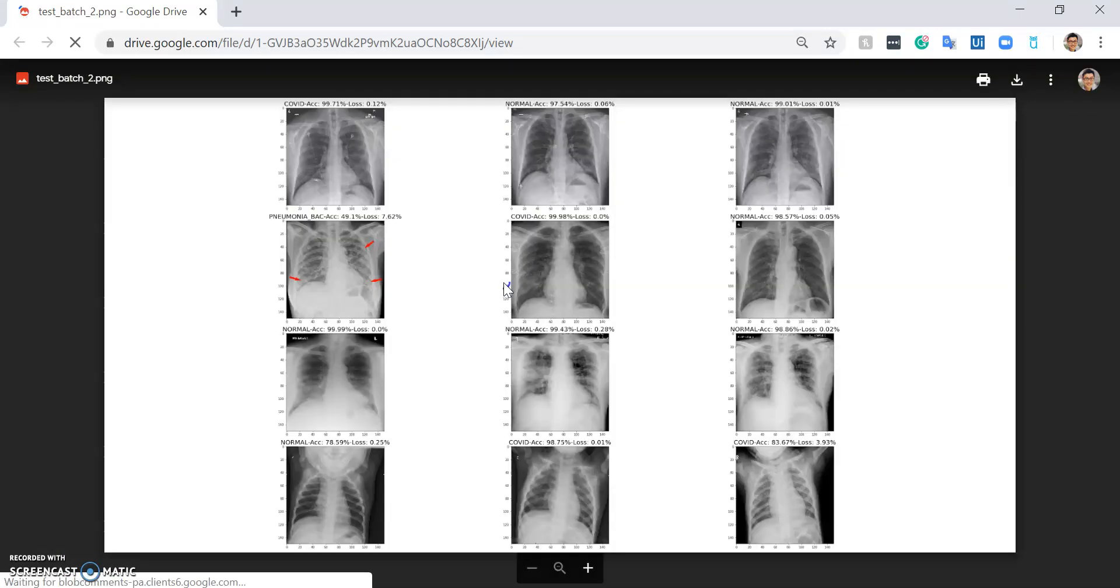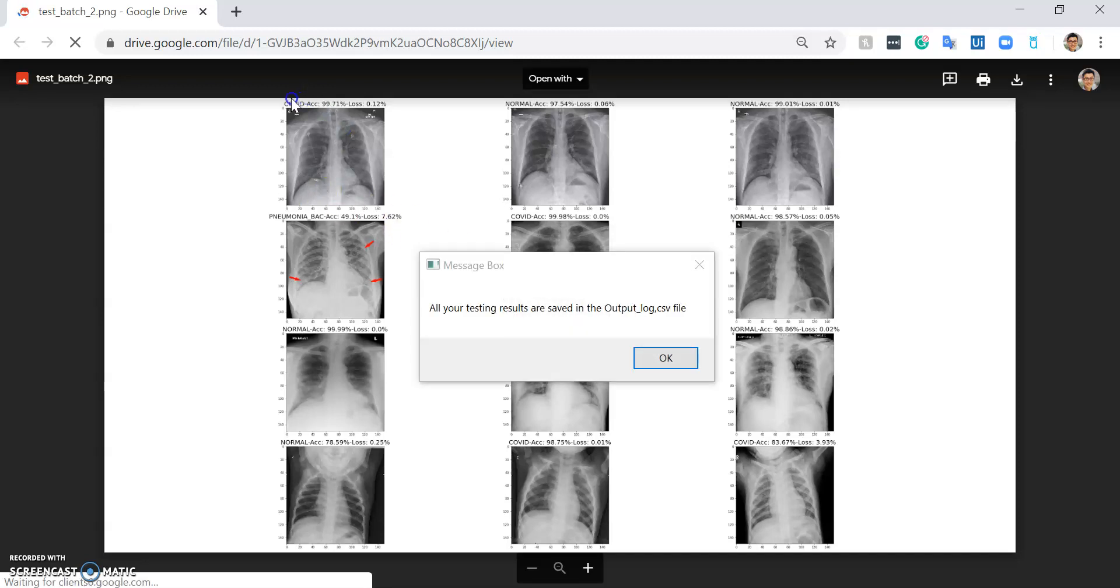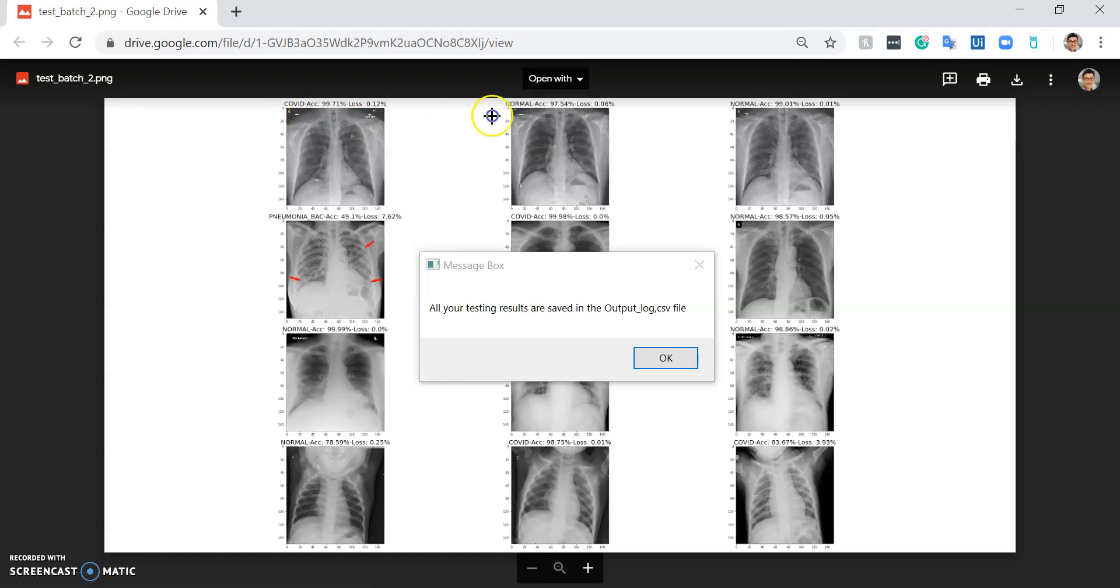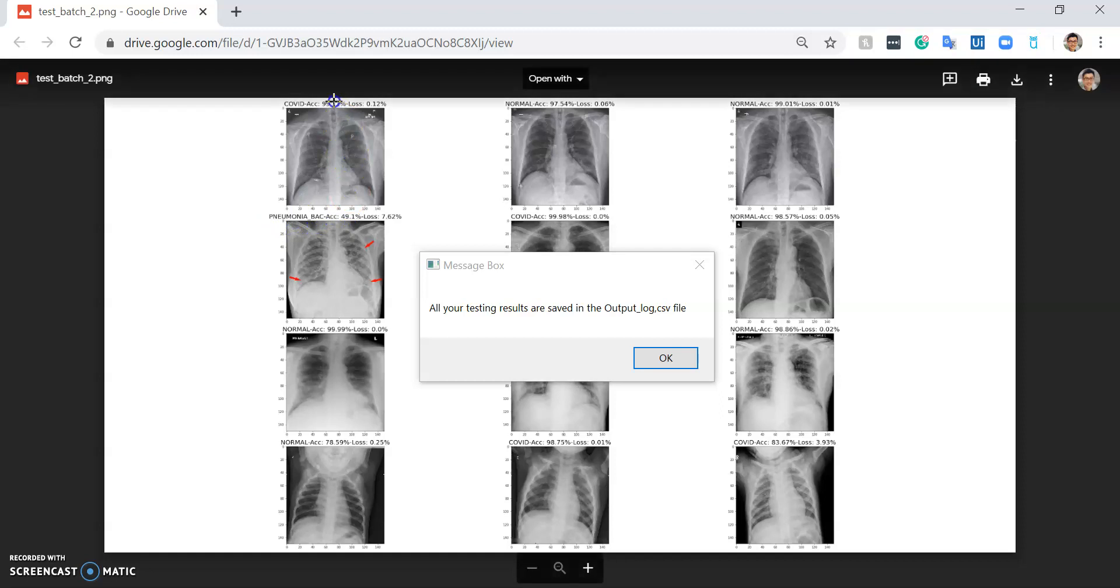After that, it will open the result for me. As you can see, the chest x-ray image will have the label indicating whether this chest x-ray image has COVID-19 signs, is normal, or has bacterial pneumonia infection, with the confidence score showing the likelihood accuracy next to it.